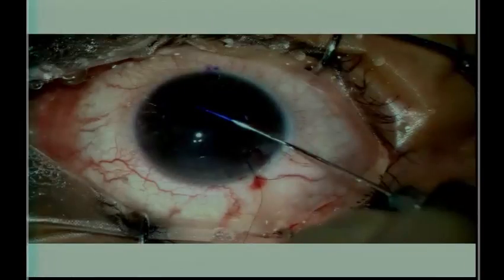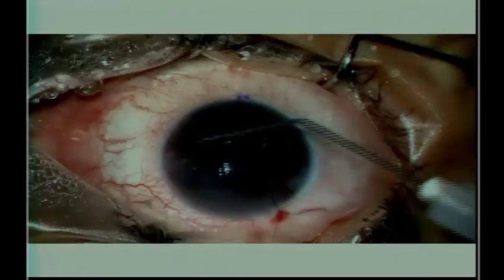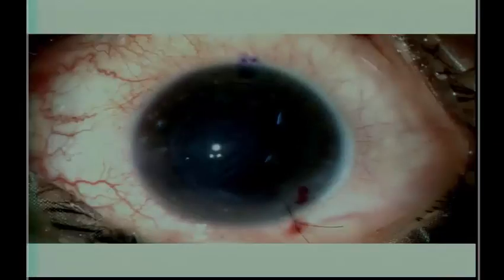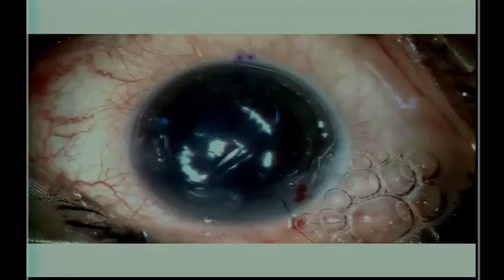So once you put it inside the eye, you secure your wound, and there you see me using a cannula to try and open up the roll, and then you can use the various tapping techniques, and there you see the F mark showing you that it's in the right orientation. If you have an expensive gadget like the intraoperative OCT, you can take the help of that, but I don't think that everybody will be able to afford one in their clinic.